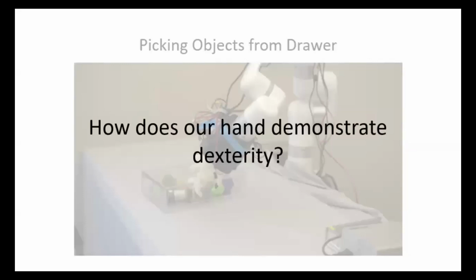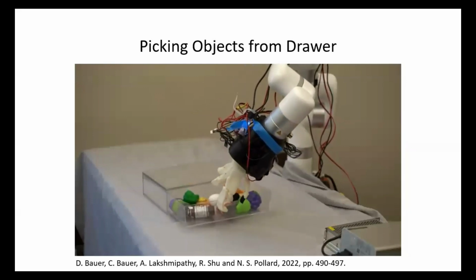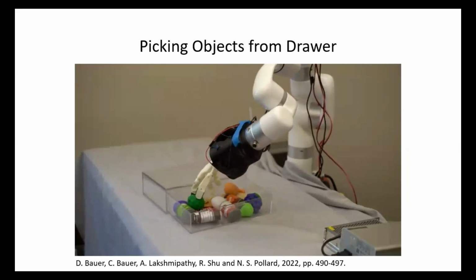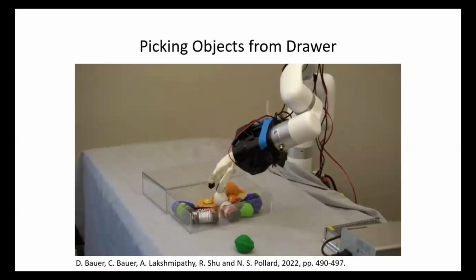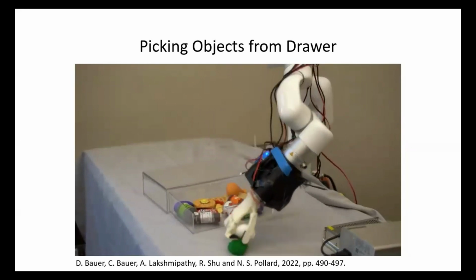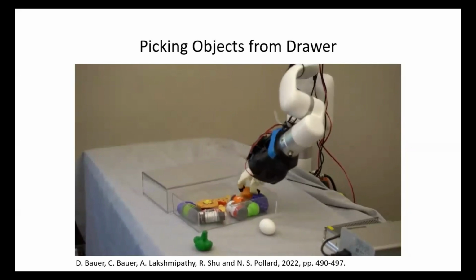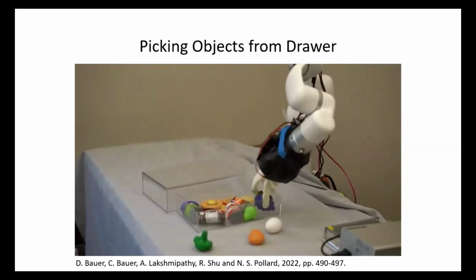We also have a lot of dexterous motion, as demonstrated in this video, where we are grabbing objects out of a drawer. You can open the drawer with even just one finger and pick up this wide variety of objects out of the drawer. Easily, just slowly moving across each one and being able to specify which object. Especially because the hand is not rigid and is able to collide with a lot of the different objects, it allows a better grasp on a lot of the objects, being able to wrap around them rather than having to adjust to slowly almost claw it out of the drawer.